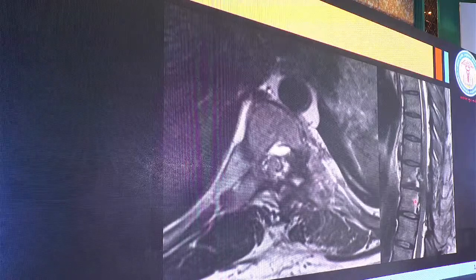However, in this particular case, what happened was that when this sac was embolized, because of the sudden thrombosis of the sac, there was a lot of mass effect and inflammation around the sac, which led to complete motor loss in the patient immediately post procedure. So the patient had to undergo laminectomy because of that. However, after laminectomy, after a few days, like 1 month after laminectomy, the patient's motor power came to 5 by 5, and the sensory symptoms also were resolved. So these are the post-treatment, post-laminectomy changes in the posterior aspect.